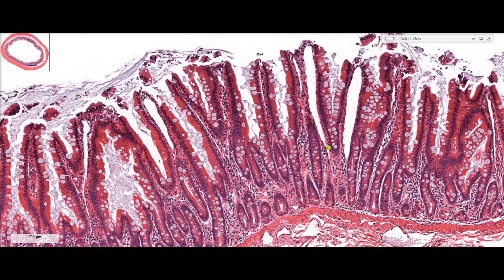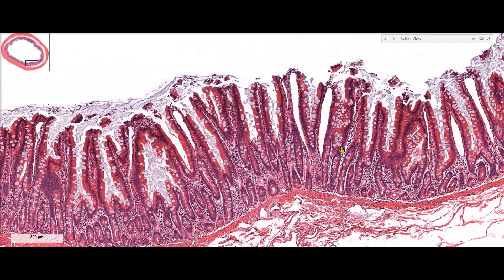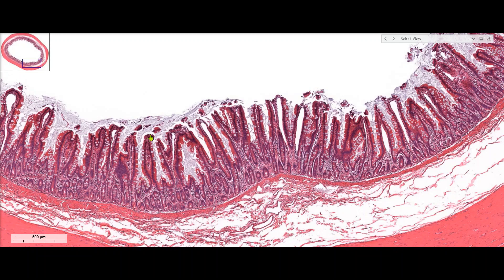Here we can see some key differences between the esophagus and the small intestine. While the esophagus had a very thick layer of non-keratinized stratified squamous epithelium for protection, the mucosa of the small intestine features a layer of simple columnar epithelium with goblet cells present. Notice how the goblet cells look like bluish-gray balloons on this slide. The reason for this difference is that the small intestine is specialized for nutrient absorption. Also notice how our mucosa is folded into finger-like projections called intestinal villi, whose purpose is to increase the surface area lining the lumen so we can do more absorption.